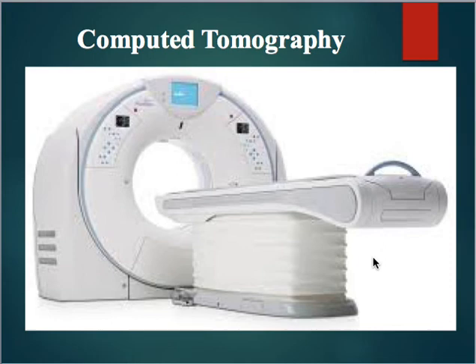Throughout the slides, I'm going to refer to a slice quite frequently when I'm referring to an image, and I'll get into that a little bit more as we go along. So simply put, tomography is just imaging by sections. When we think about CT, a lot of times I use the reference of a loaf of bread.